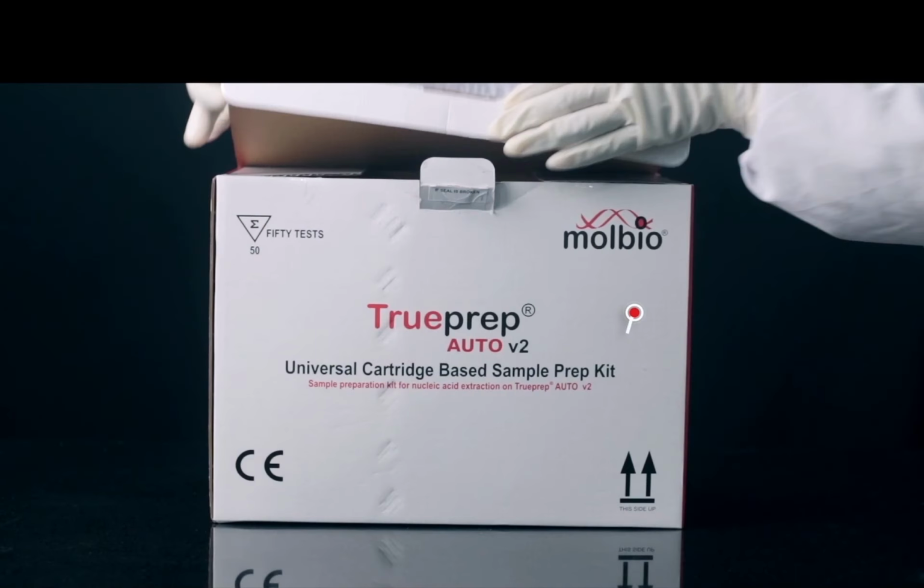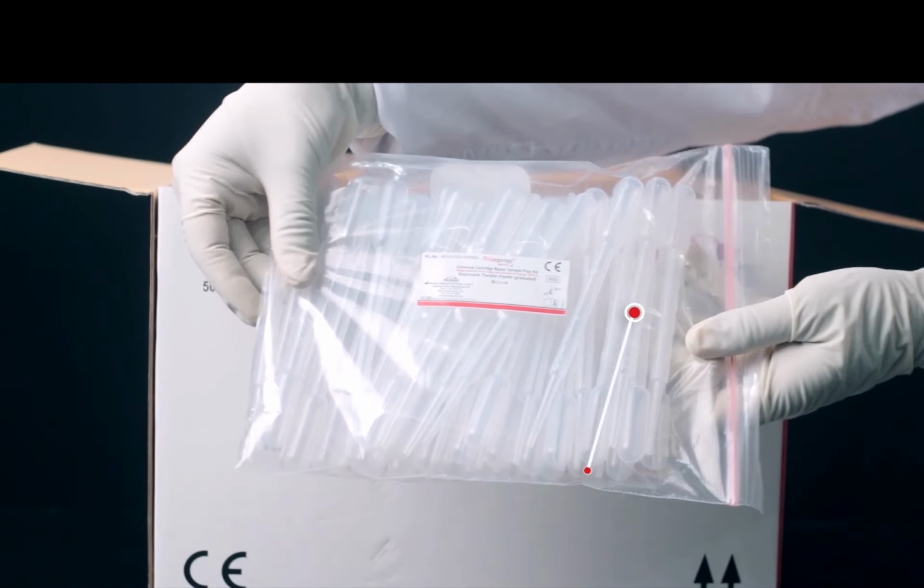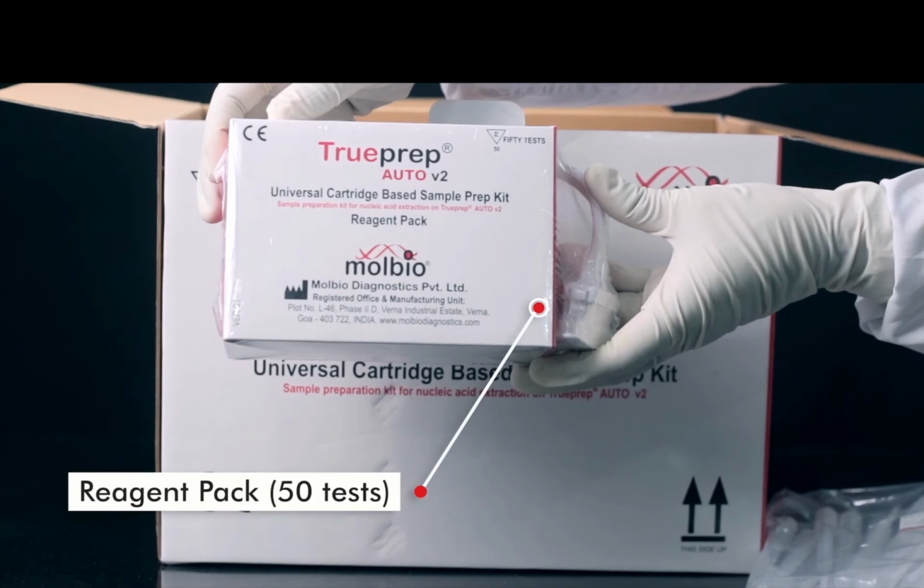Now we have to do DNA extraction, which uses a cartridge-based sample prep kit. Here again, a 50 test cartridge-based sample prep kit is there. With this you get a 3 ml disposable pipette. Then you get a reagent pack, also for 50 tests. This pack is attached behind the extraction device. We'll discuss in part 2 of the training how to change a buffer pack.